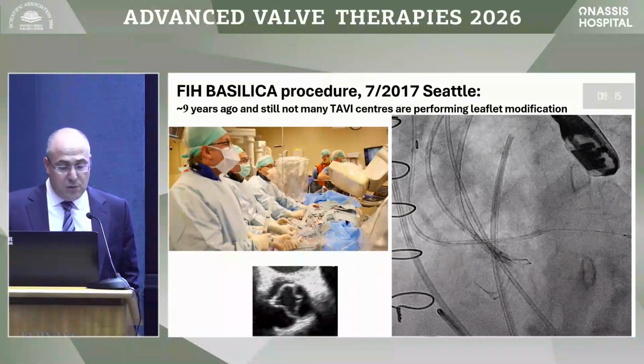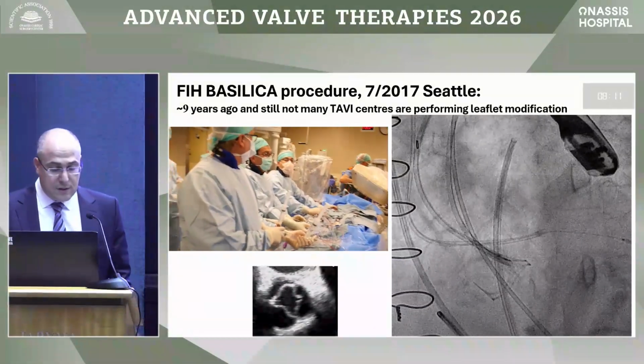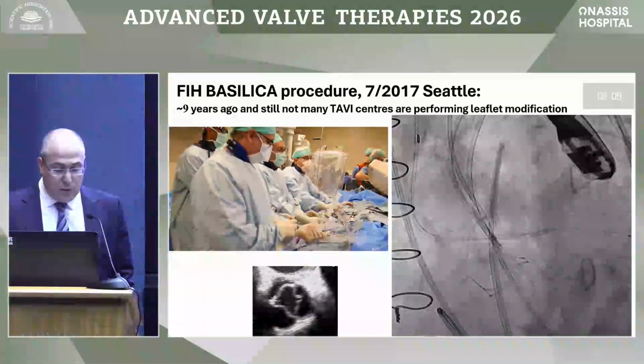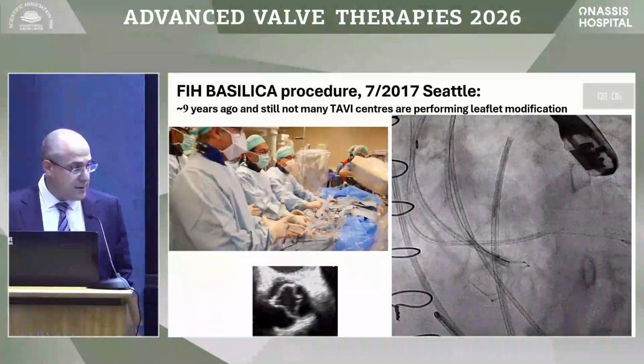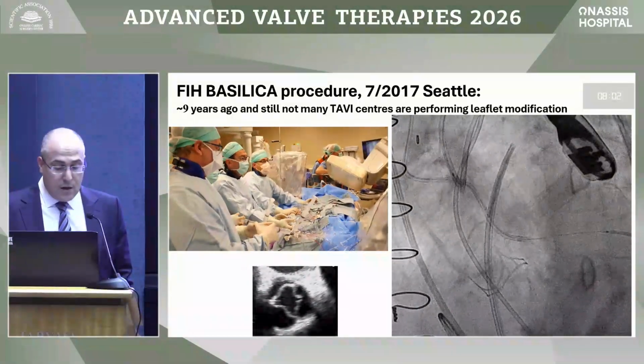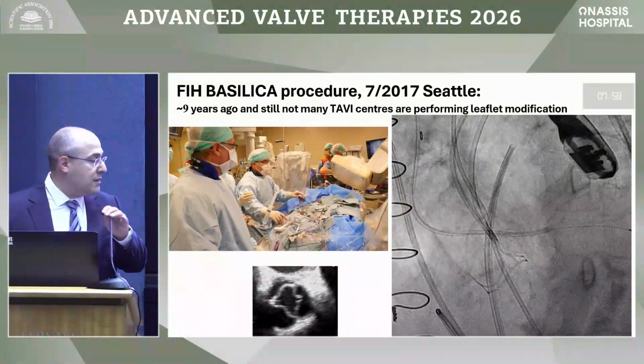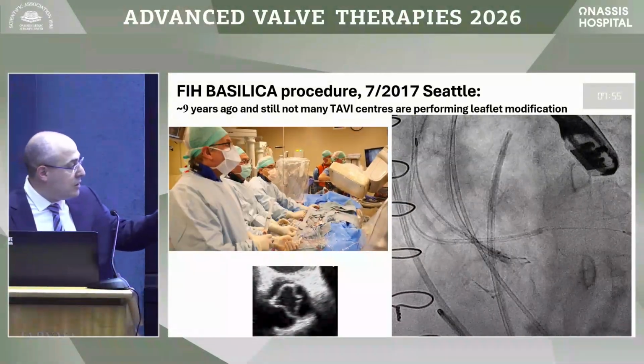So the first in-human Basilica procedure was almost 9 years ago, and we did it in several cases of Basilica in Seattle. Unfortunately, not many centers worldwide, or not enough, are doing leaflet modification. Do you do?